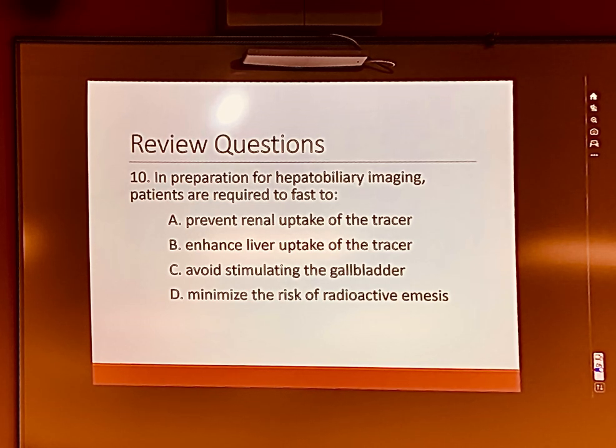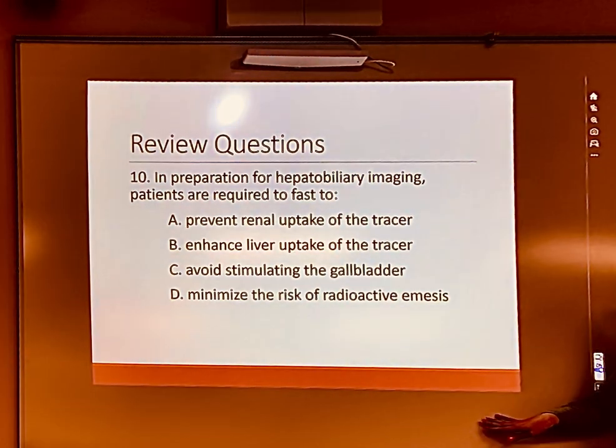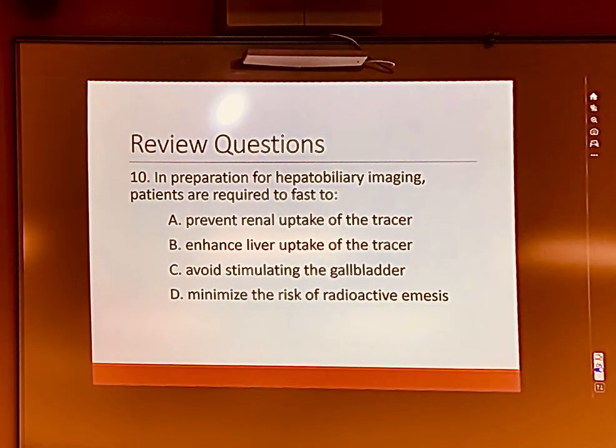Would a patient with a HIDA scan ever have radioactive emesis? Emesis is vomit. No. A patient would never have radioactive emesis from a HIDA scan because the medication that you give them is only taken up by the hepatocytes, and you don't have hepatocytes inside your stomach, which is where vomit comes from, right?